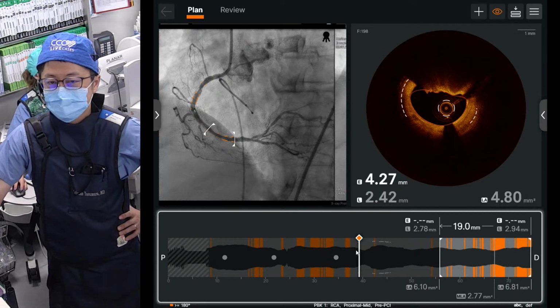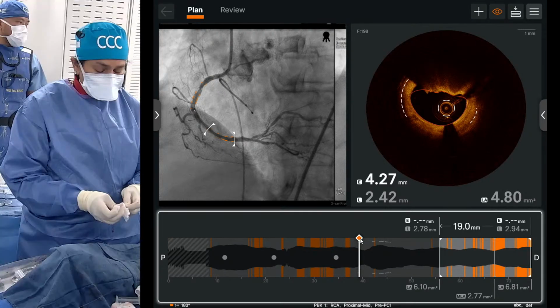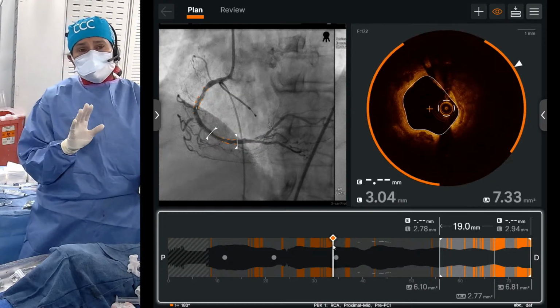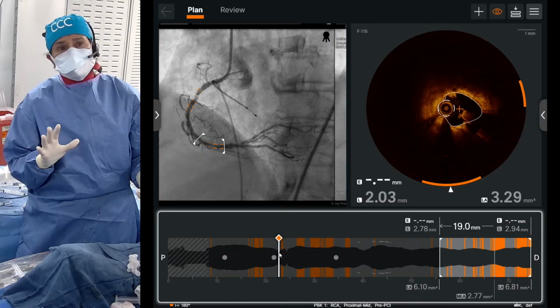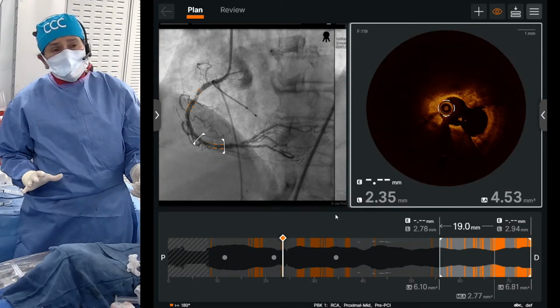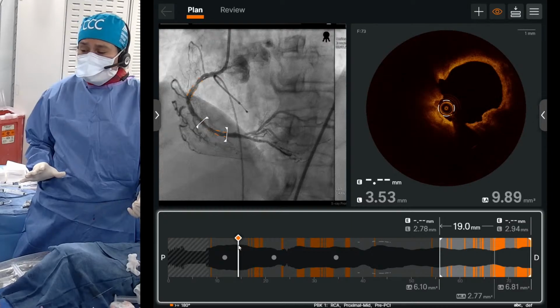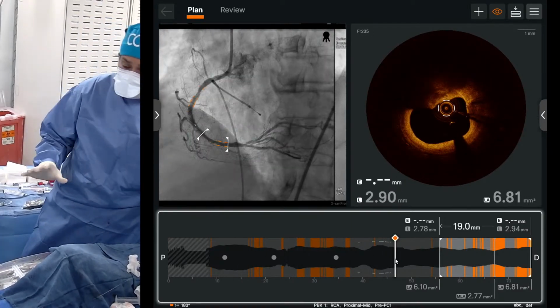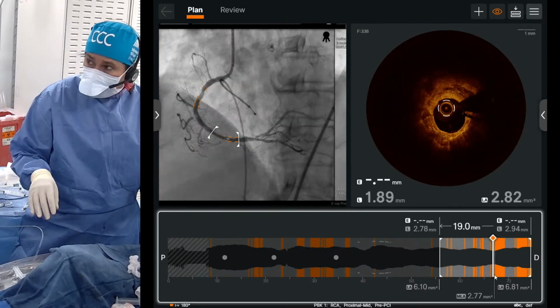Reasonable. Our algorithm was based on the arc. Okay, but we never included the thickness. So in many places you've seen that arc. In the majority of places it's less than 180, and in a few places it's more than 180. And probably we saw nodule in definitely 2 areas, right? Yep. Yeah. So go back to that algorithm, please.